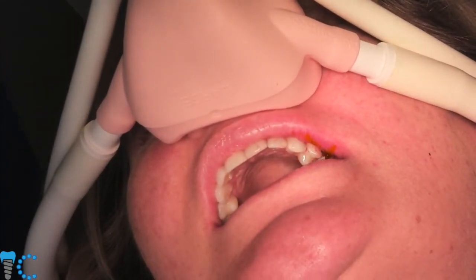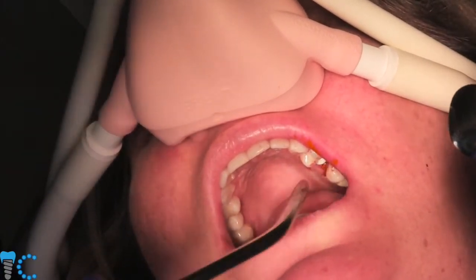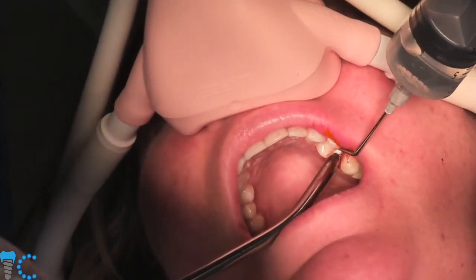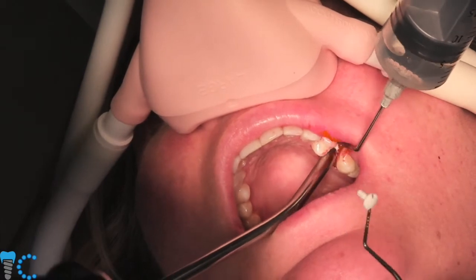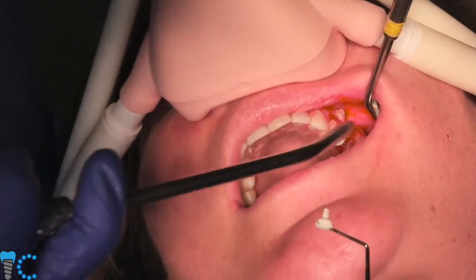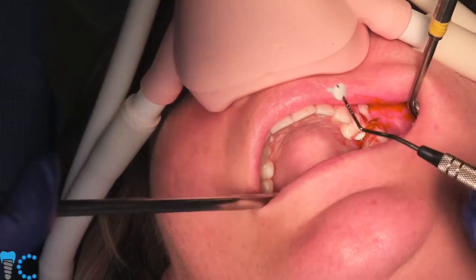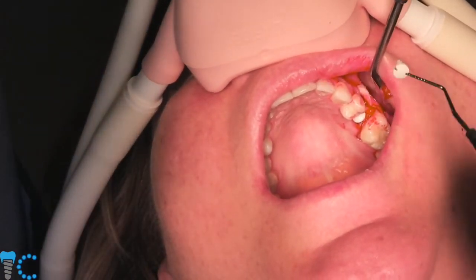It's incredible. All right, so what we're going to do next is we use a perioprobe type instrument to attach our healing cap. This is our healing cap, and what we found nice about this, using the perioprobe, our healing cap stays steady here. There's a little groove in the top of the healing cap, and we use that to stabilize our healing abutment.